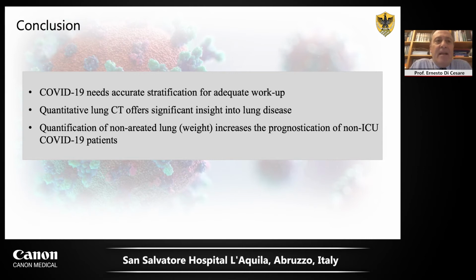So we can conclude from our experience that COVID-19 needs an accurate stratification for adequate workup. Quantitative lung CT offers significant insight into lung disease, and it seems really interesting that quantification of non-aerated lung weight increases the prognostication of COVID-19 patients.